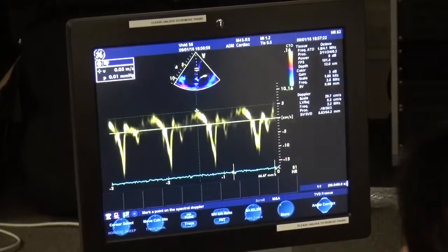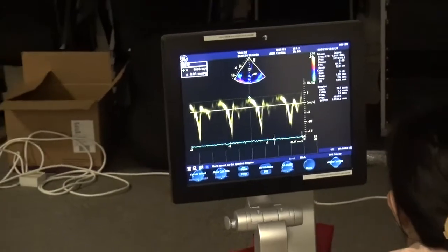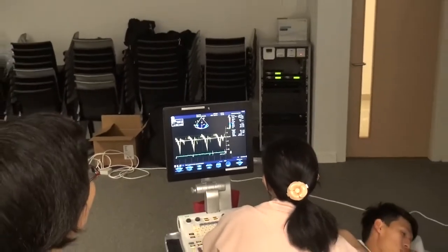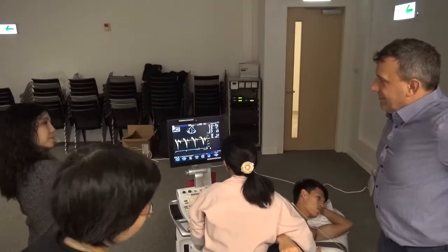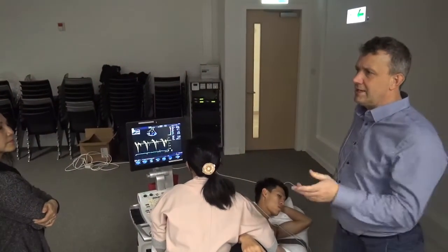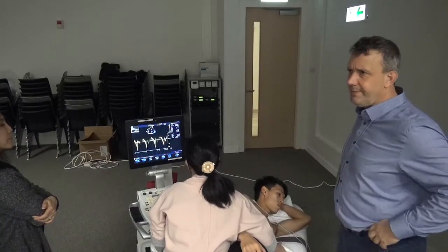Okay? So mostly you just do the longitudinal. We never do any tissue velocity transverse assessment. It's just too variable. I see. And so from our perspective, it doesn't have the right sort of repeatability. If we're going to do transverse measurements, we'll stick to strain.